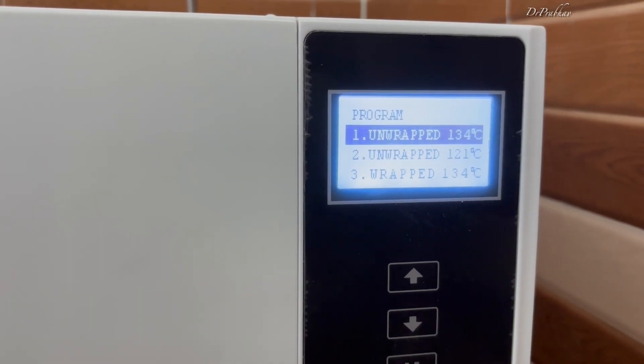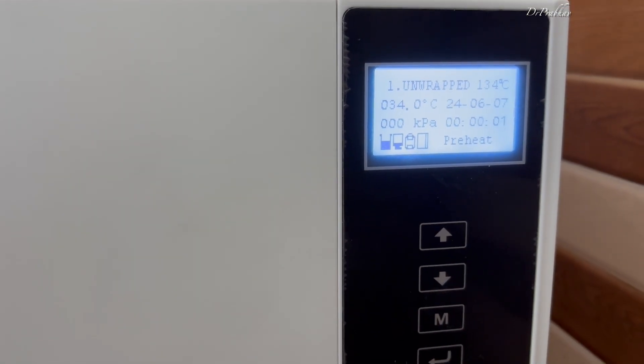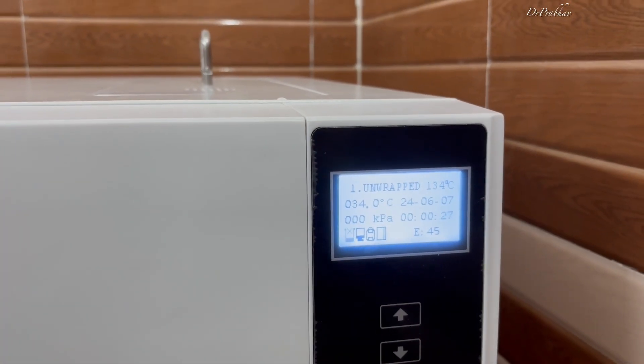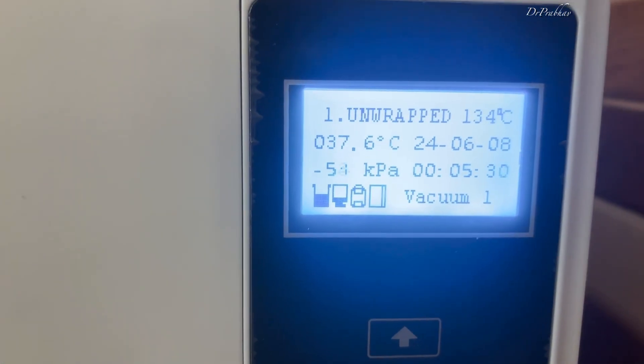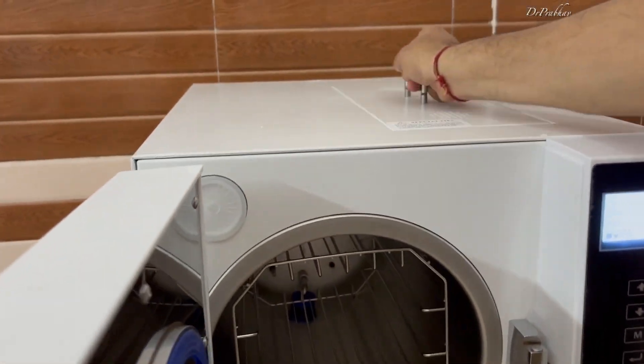There are three important steps when using this autoclave, or any autoclave generally. The first step is that there are pre-installed programs — we need to select the program. For example, 134 degrees Centigrade is the pre-determined program in unwrapped mode. We will use the instruments in this mode for autoclaving.